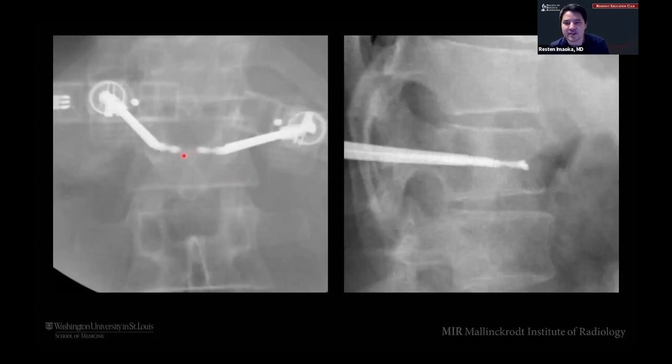So here you can see they're spaced out a decent amount apart, right? Because the RF goes a little bit beyond these electrodes here too. So we're very far anterior, and we're about a spinous process apart. These ablation probes, depending on what you're using, you will know the size that it makes, right? So we happen to know for this one, the largest it's going to get is about a 3 by 2 centimeter ablation zone, which means you're probably not going to get the entire thing, right?